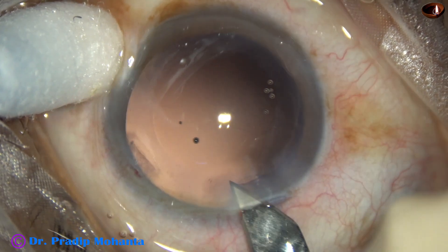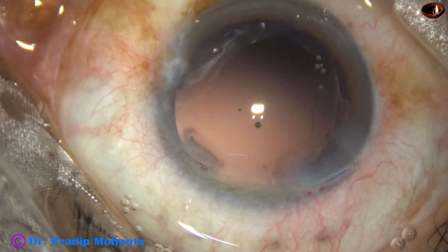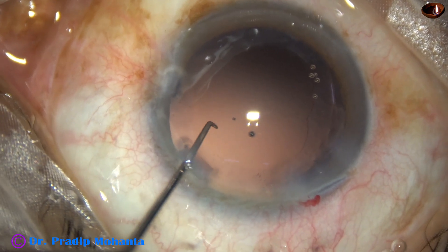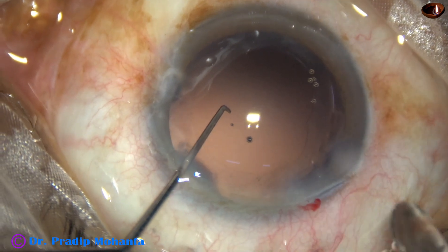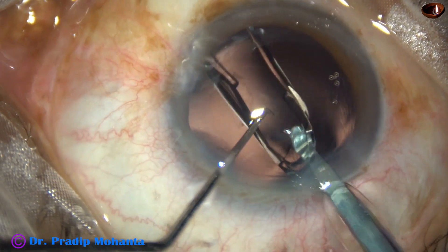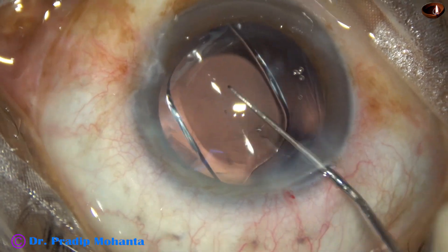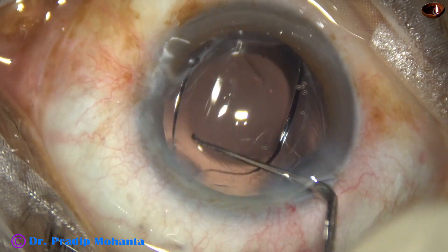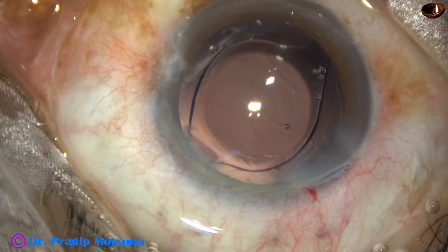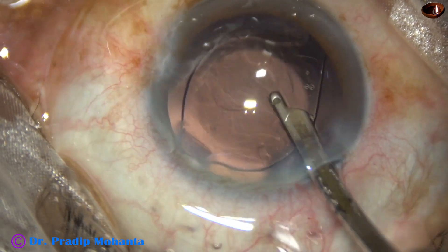Now, for implantation of the intraocular lens, the main wound has been enlarged a little bit — it was initially 2.8 mm, now it is about 3 mm. A B cartridge is used to implant a hydrophobic acrylic single-piece monofocal intraocular lens. The lens has gone into the capsular bag. If one haptic is outside the capsular bag, you can dial it — dial and press at the haptic-optic junction — and it goes into the capsular bag.